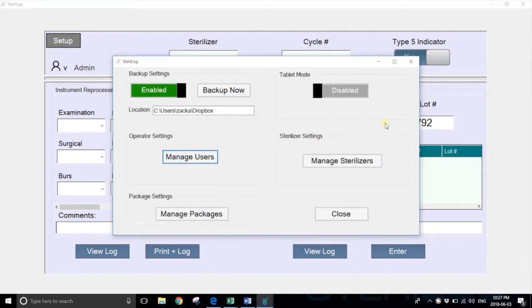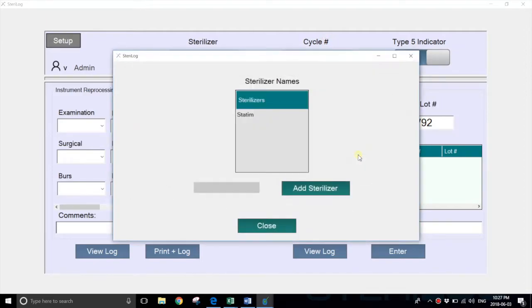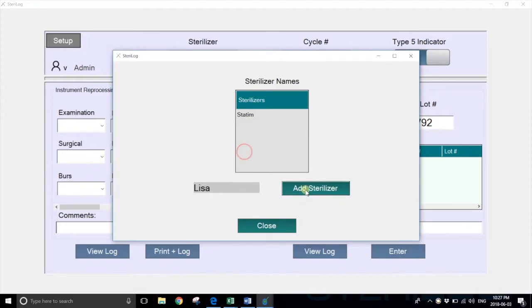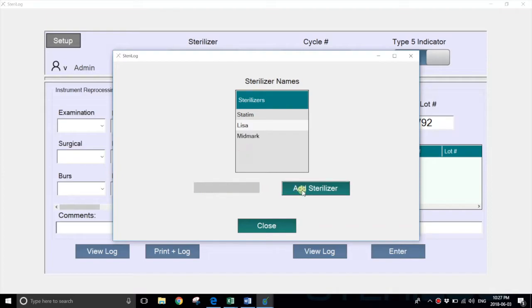You'll then want to add some sterilizers. If you hit manage sterilizers, you'll see that Statim is already loaded in the system. But if, for example, we wanted to add Lisa, we'd simply key it in and add sterilizer. We could also add Midmark or any other sterilizer.